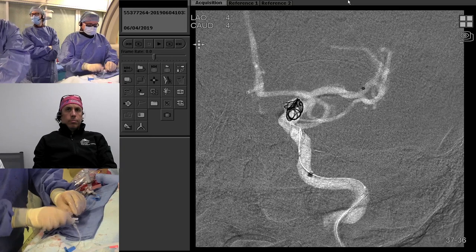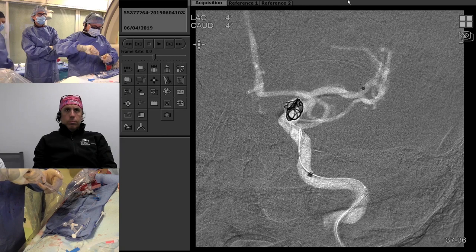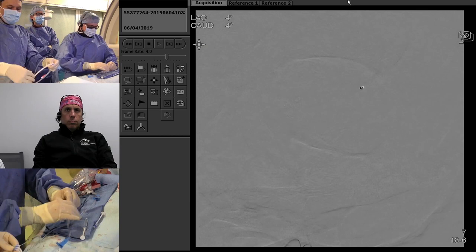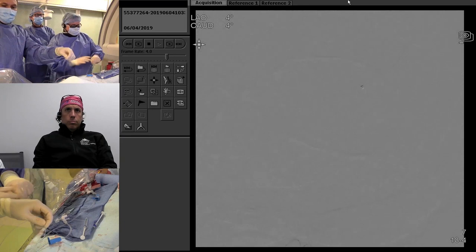Triaxial systems for delivering these kind of stents is standard — mostly because with braided stents, especially ones that get to larger diameters and lengths, they can be a bit stiff and harder to push with more friction. Decreasing the step between the catheter and the vessel wall can help, taking some loops out of the push. That's why the DDC is up as high as it is — right at the ascending to horizontal petrous segment transition point.